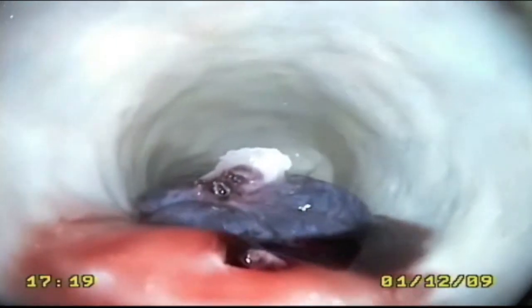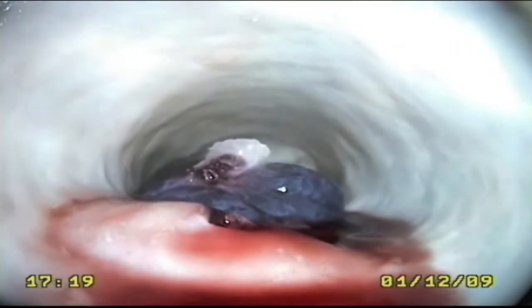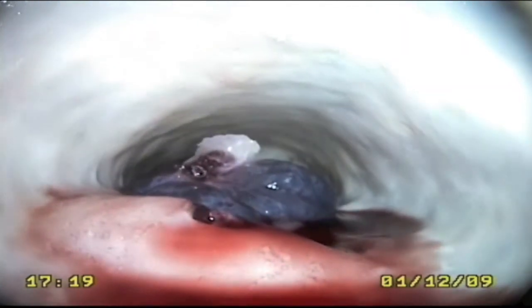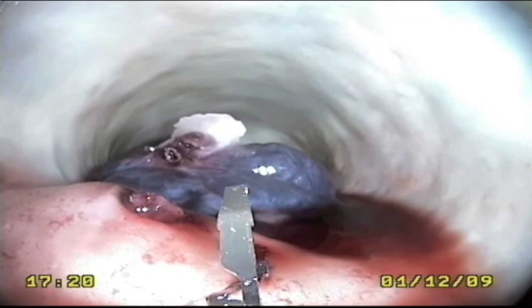Where necessary, simulated bleeding can be created for the user to practice different forms of haemostasis. In this case, the participant uses an endoscopic clip to stop the bleeding. The clip is positioned over the bleeding point and released.